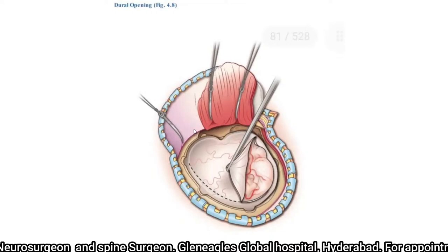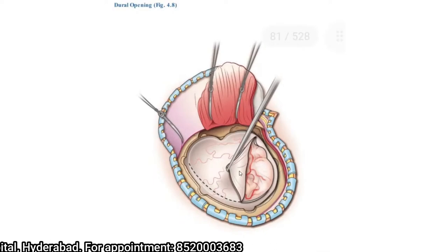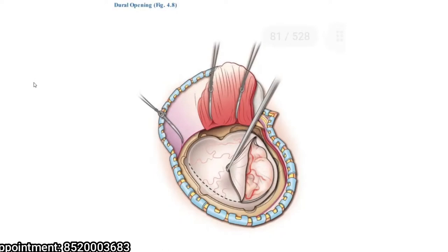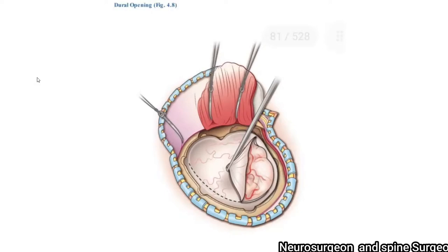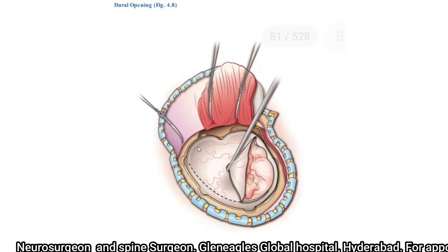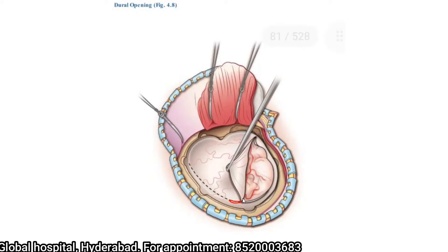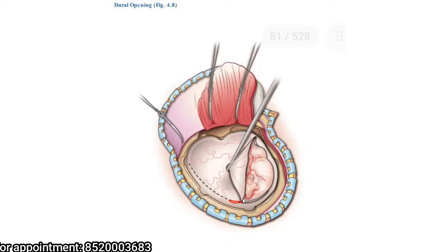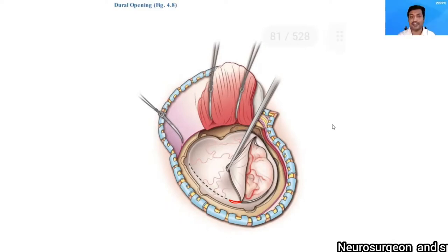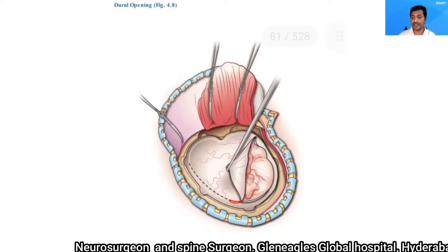When opening the dura, you should open it centimeter by centimeter. This is to prevent a sudden prolapse of the injured edematous brain and to prevent sudden decompression, which can cause a tear in the venous sinus and cause bleeding. When taking the cut in the dura matter with scissors, ensure that you are visualizing the undersurface of the dura matter so that if any veins are seen, you can delicately separate them from the dura matter, preventing injury to those veins.